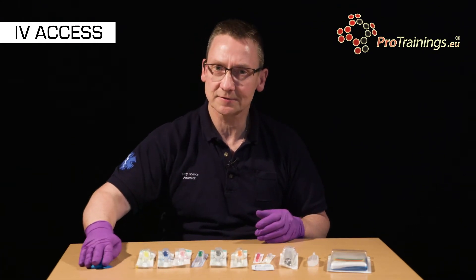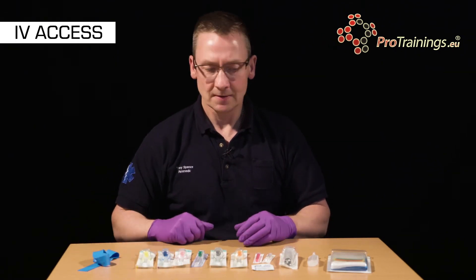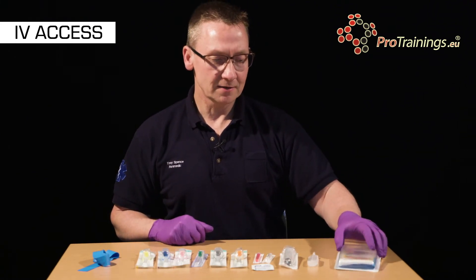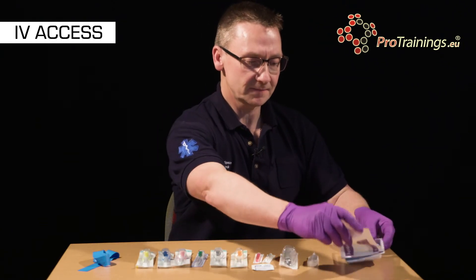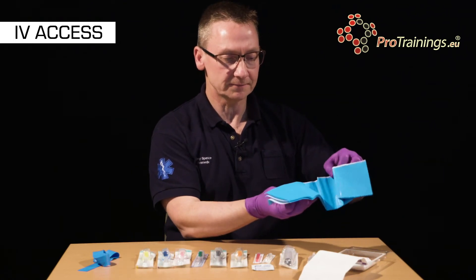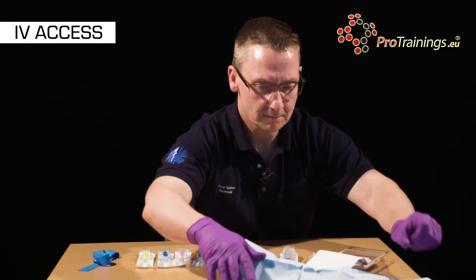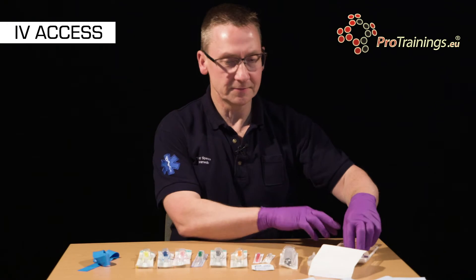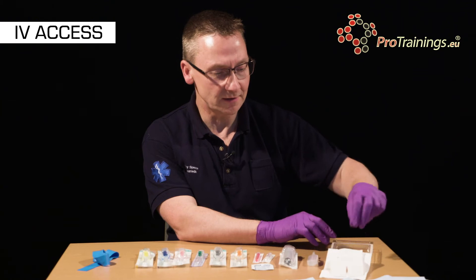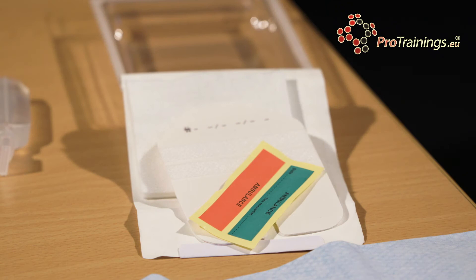These are disposable single use only and they can be quite uncomfortable because they're made of sticky rubber. We need to create a sterile field. Inside our cannula pack we have a number of dressings that we can use to create that sterile field, and some devices for securing the cannula in place and for identifying where, when, and who placed the cannula.